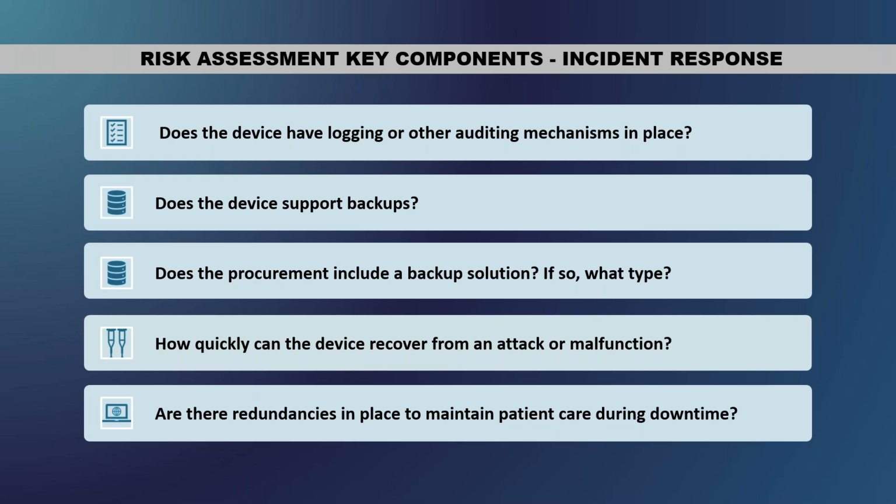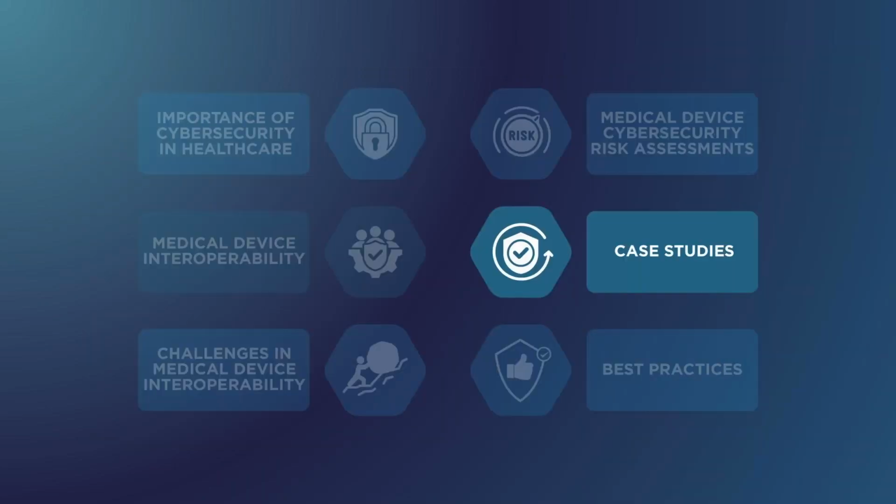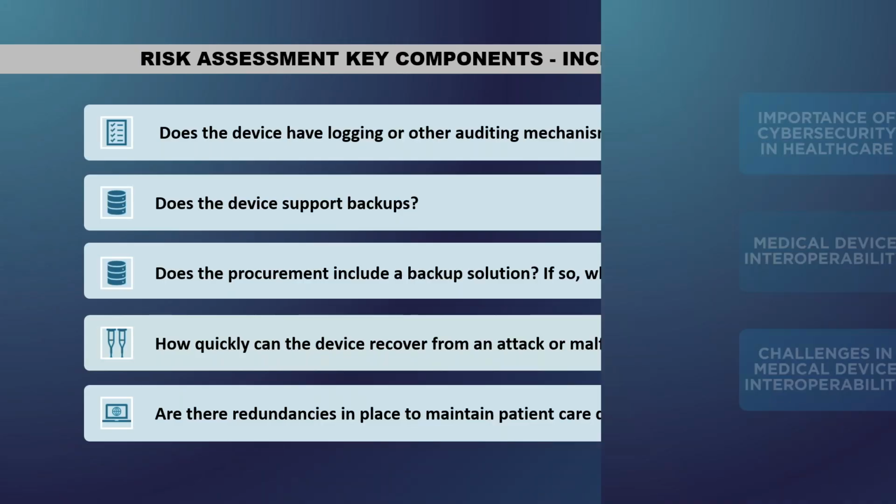A lot of times we have Commvaults for server access. Those are things you have to think about, because like I said, a lot of times it's not thought about during the procurement process. And the redundancy: if it is a server management system, does it have a backup? Do we have something in place? Can we do that? That's when you start asking the vendor these questions.